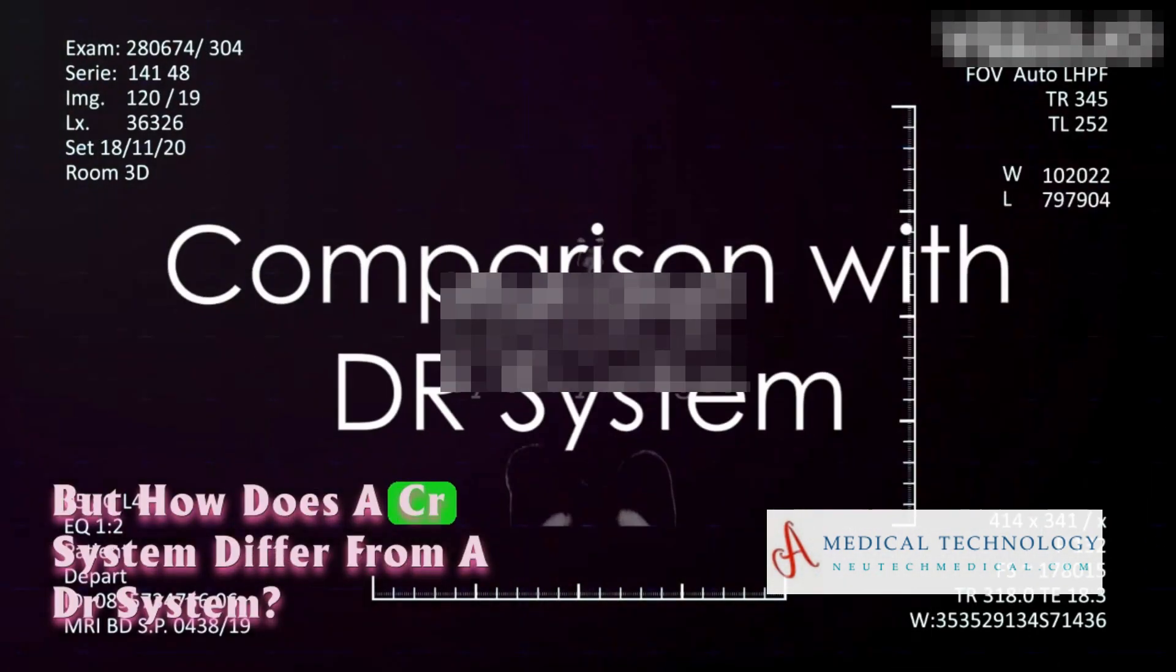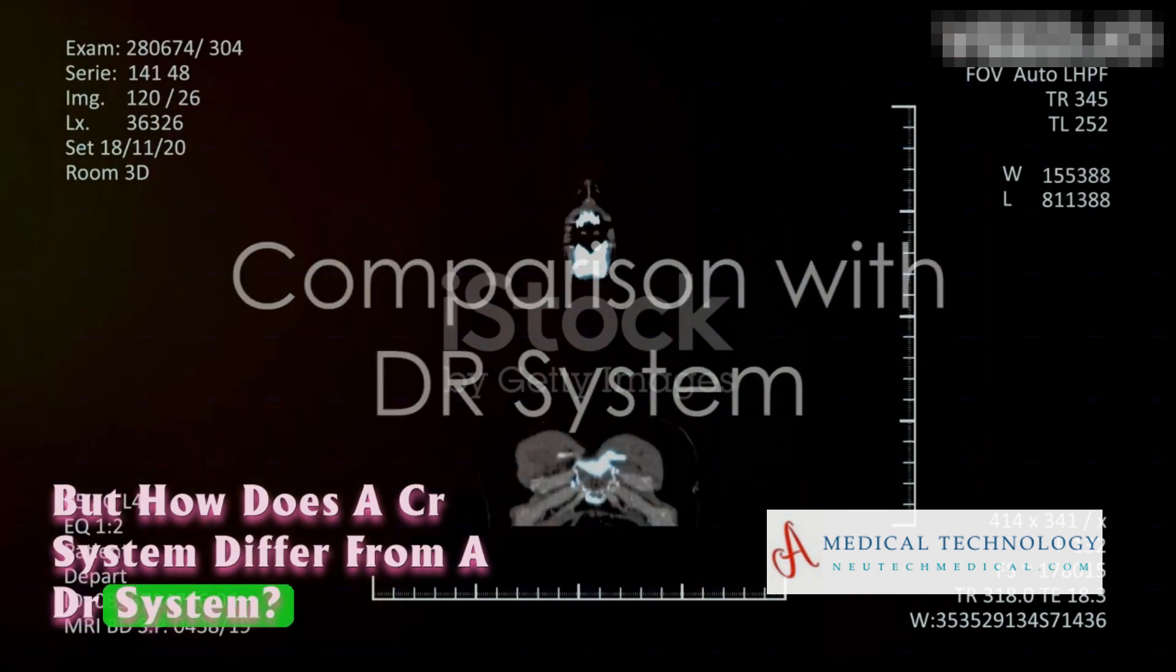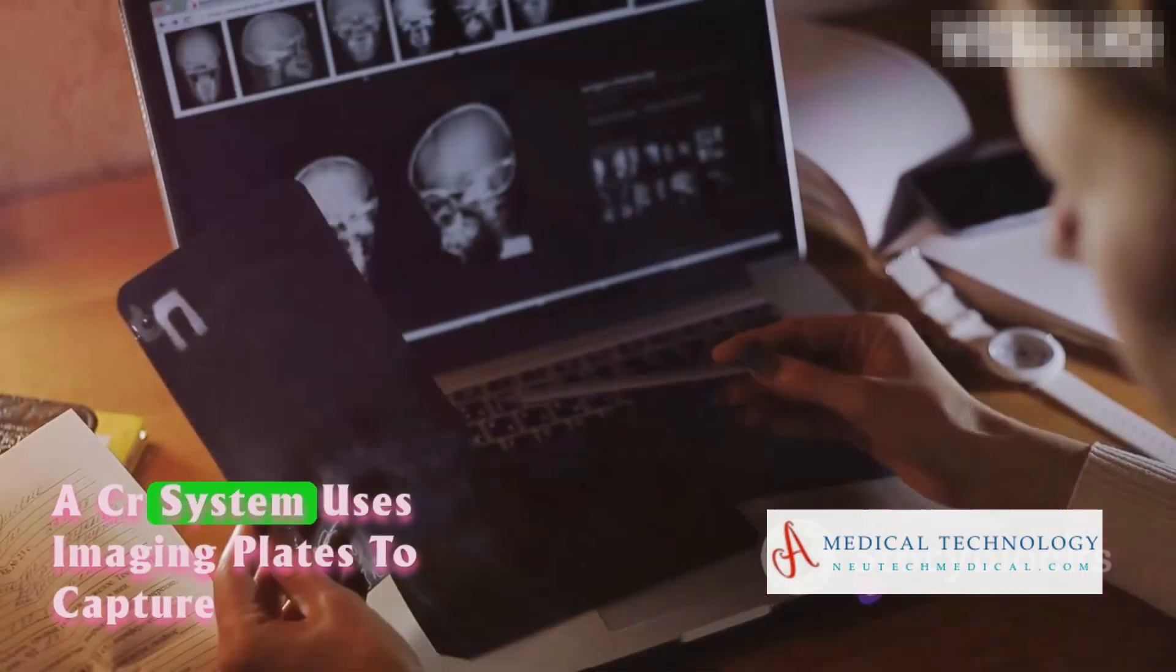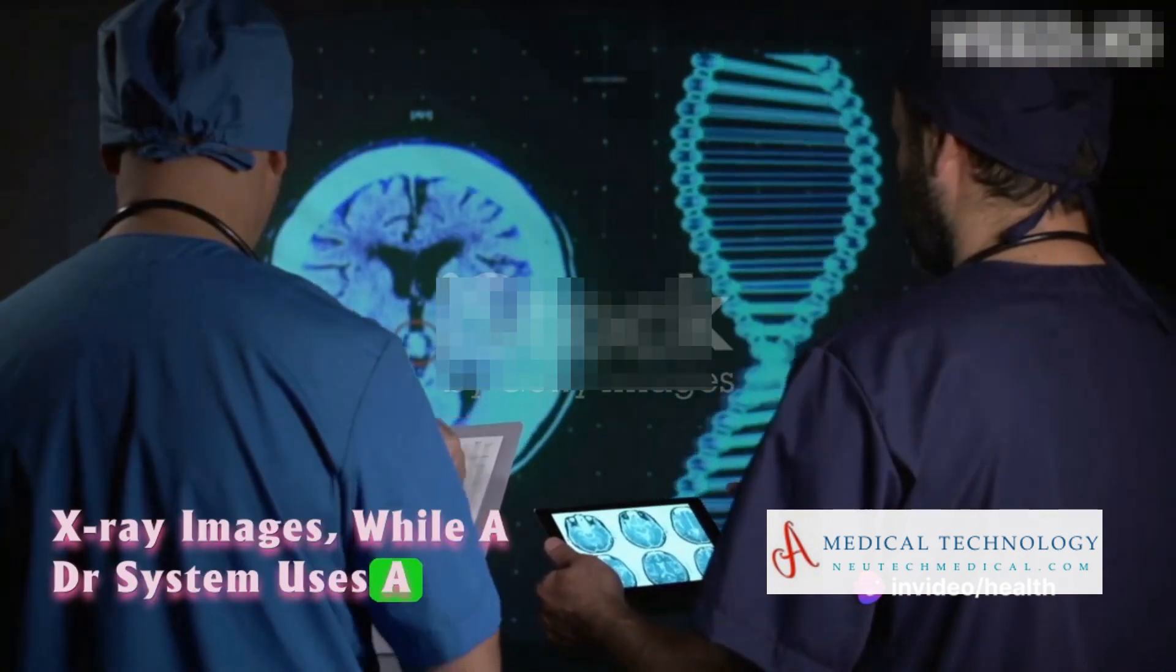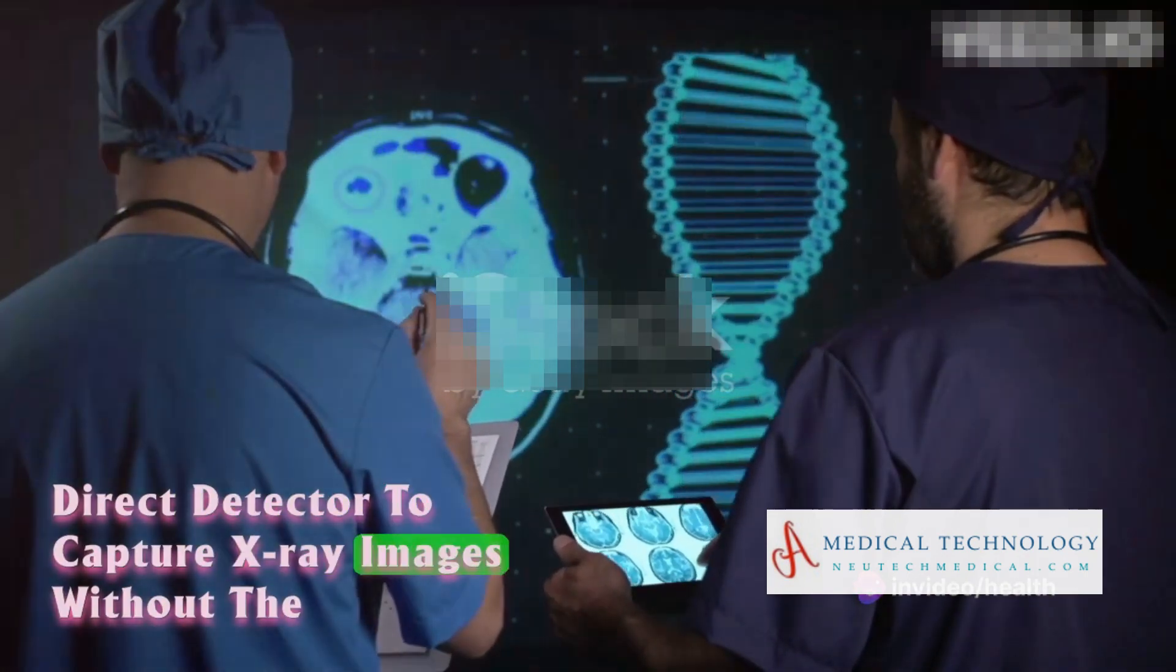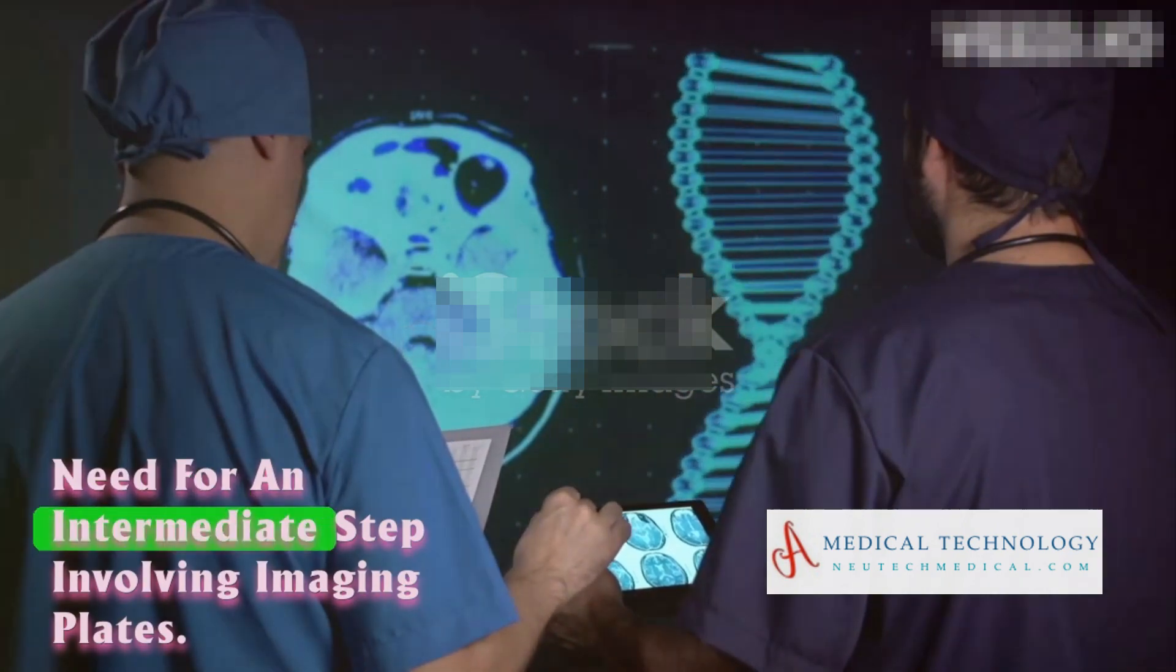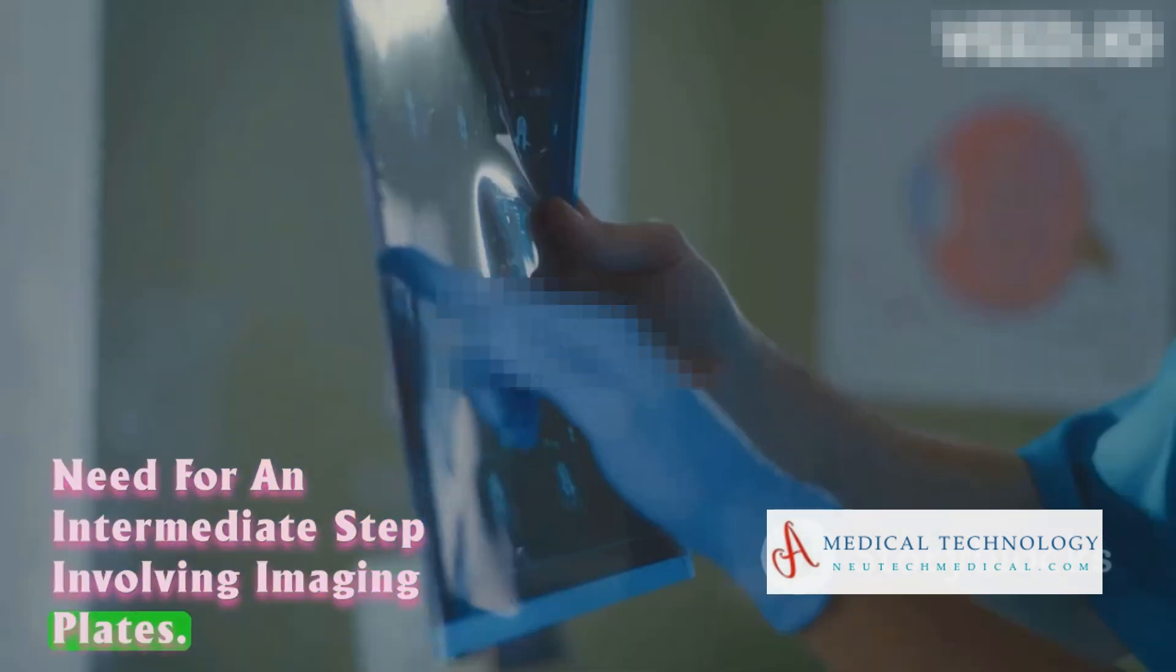But how does a CR system differ from a DR system? A CR system uses imaging plates to capture X-ray images, while a DR system uses a direct detector to capture X-ray images without the need for an intermediate step involving imaging plates.